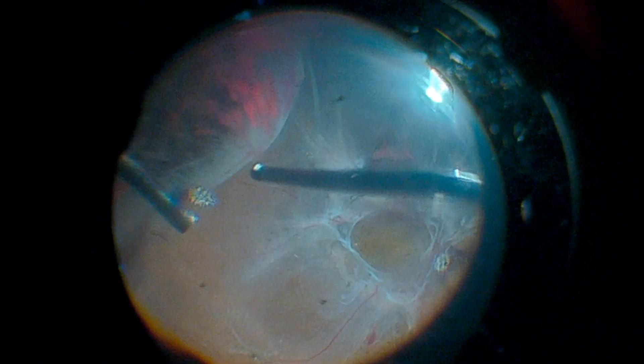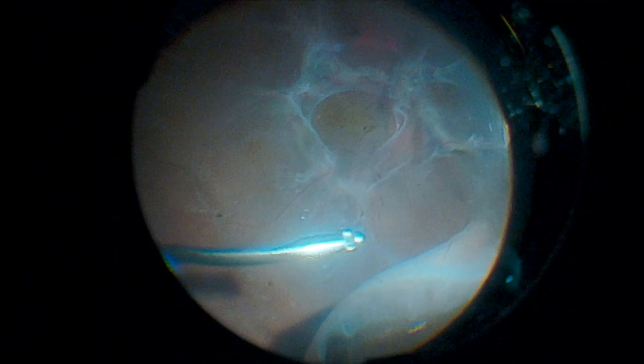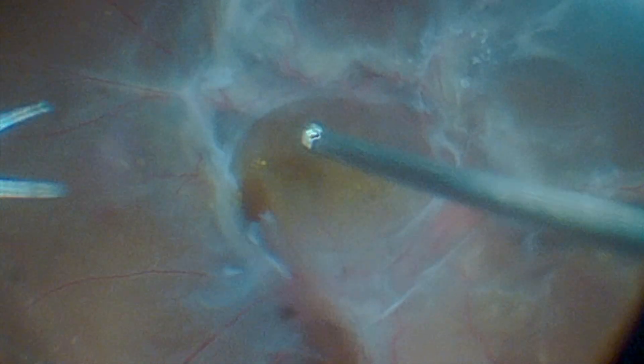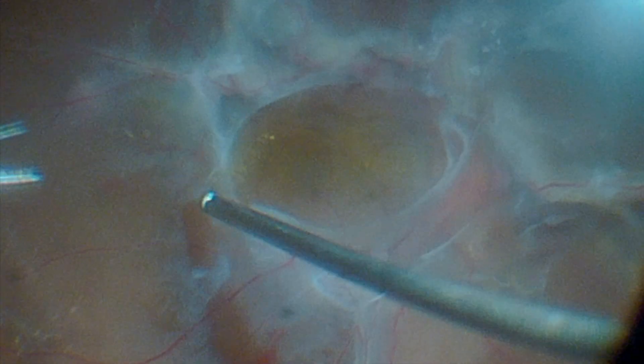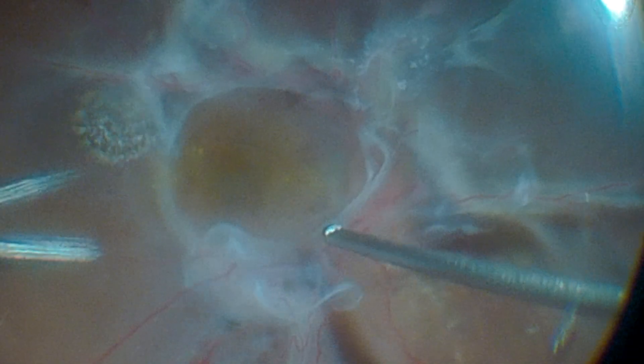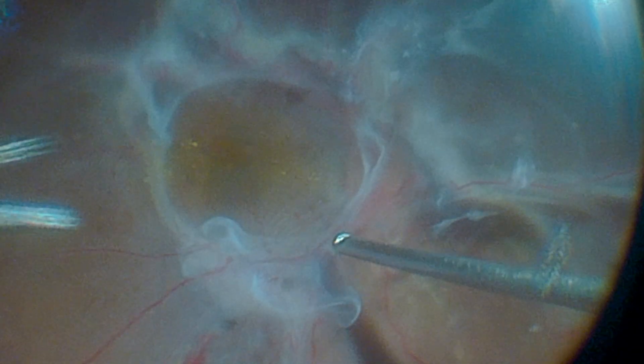After the separation of the peripheral vitreous, the surgeon performs vitreous base shaving. Next, the traction points at the posterior pole are addressed by segmenting the traction areas of the arcades with the vitrector. This relieves the retinal traction exerted by the fibrovascular proliferation areas.